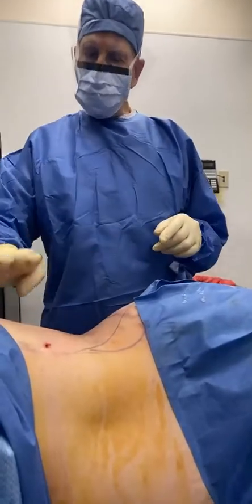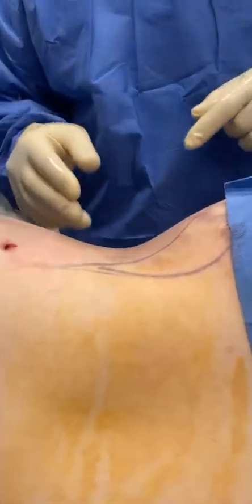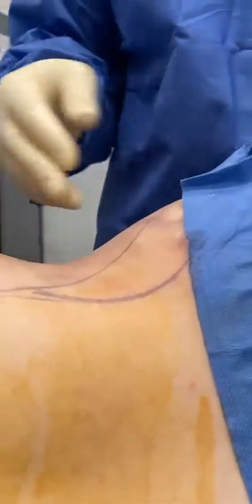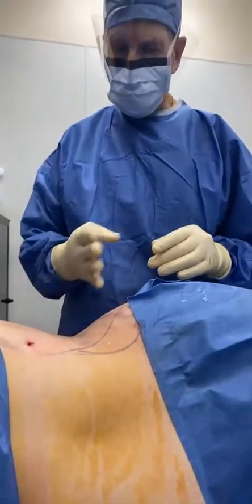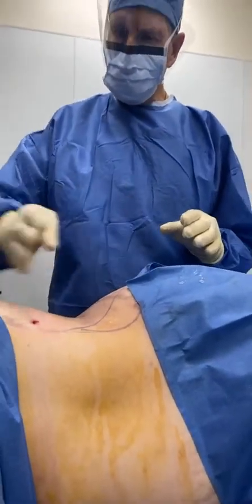Can you see the waist now? Yeah, nice curve in there. She looks good — not much excess, and we're not even done yet. She's on her side, buttocks over here, and that's the waist right there.